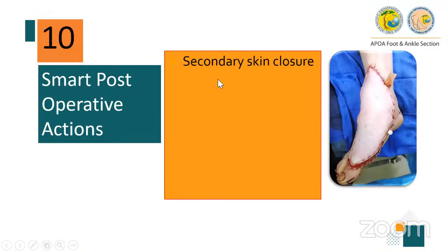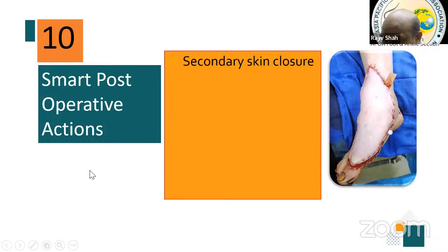So any particular plate would have been used if you had fixed with a plate? The plate for the calcaneocuboid joint is the one which we use for the cervical spine, anterior ACDF. So it's an H-shaped plate. Now so many such plates are available, like a rectangle plate, or H-shaped plate, or plate for cervical spine fusion. You can even use a straight plate with two or three holes for the calcaneocuboid joint. But the trajectory of passage of screws in the calcaneocuboid joint is very, very difficult.